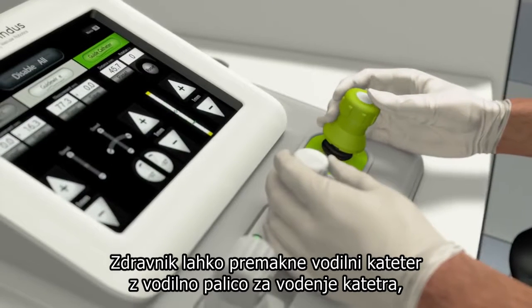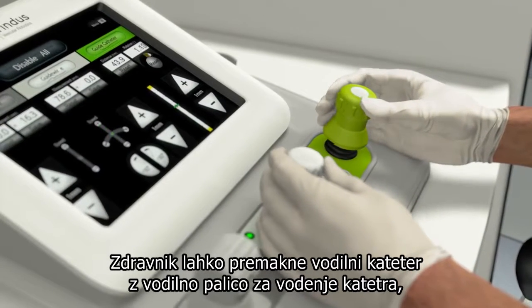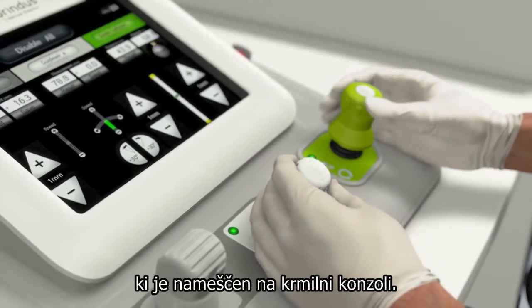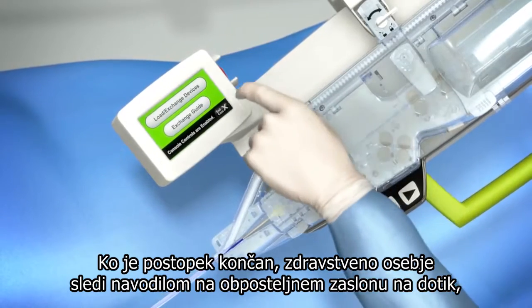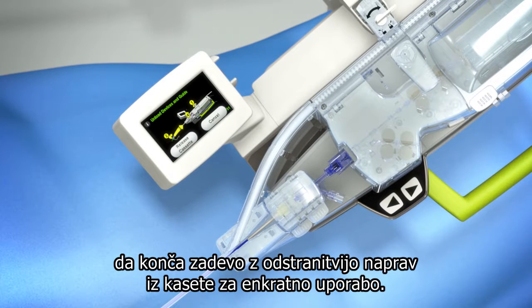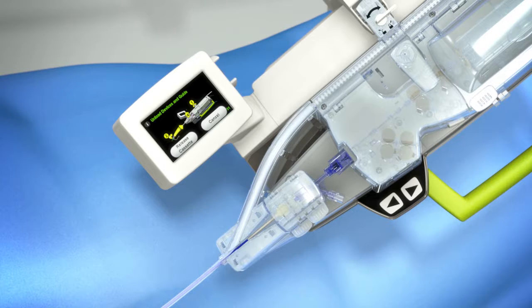The physician can reposition the guide catheter using the guide catheter control joystick located on the control console. When the procedure is completed, the Scrubs staff follows the instructions on the bedside touch screen to end the case by removing the devices from within the single-use cassette.